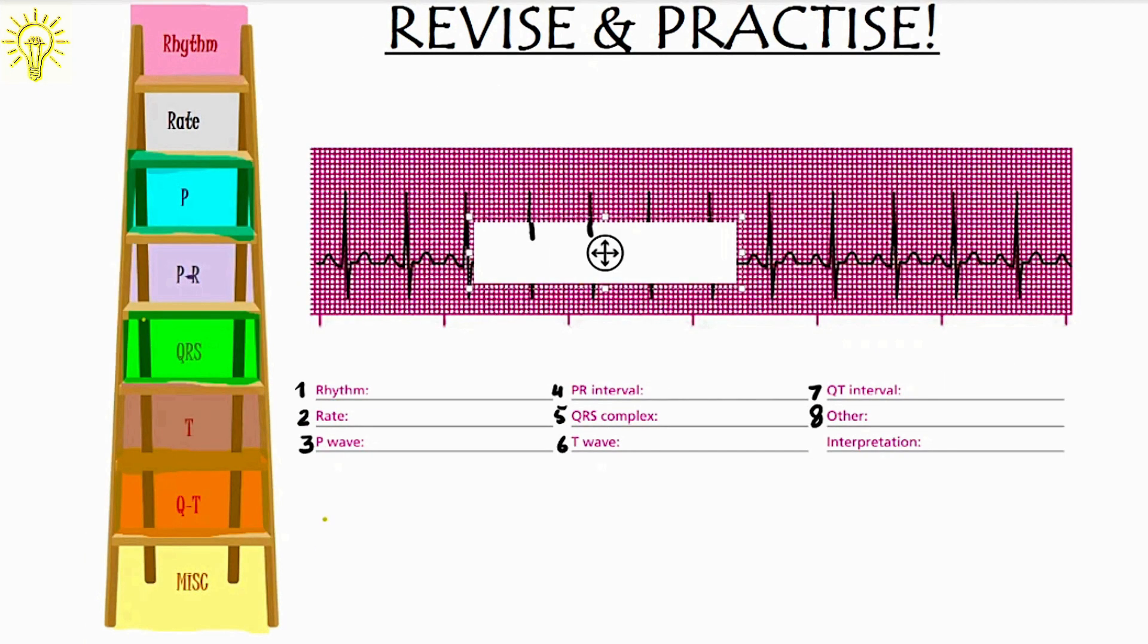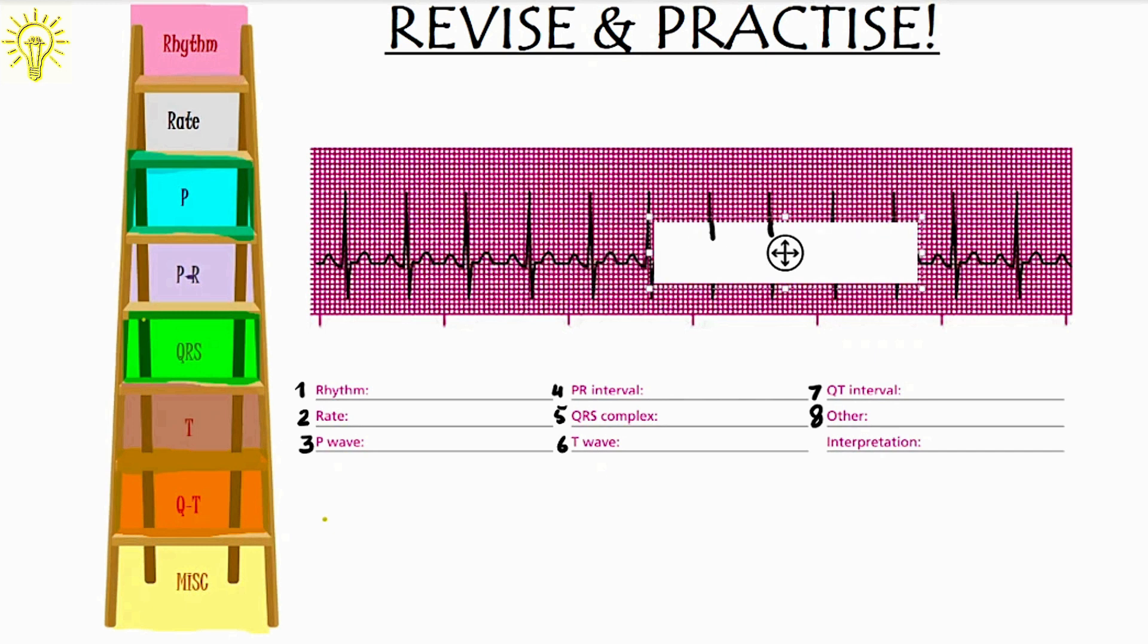In this ECG, the rhythm seems very regular. So, I would write it's a regular rhythm. The heart rate by 1, 2, this is 5 large box, this is 10 large box. So, 20 and 30 large boxes make 6 second strip. In this 6 second strip, I have 1, 2, 3, 4, 5, 6, 7, 8, 9, 10, 11 and 12. So, 12 into 10 is 120. So, rate is around 120 beats per minute.